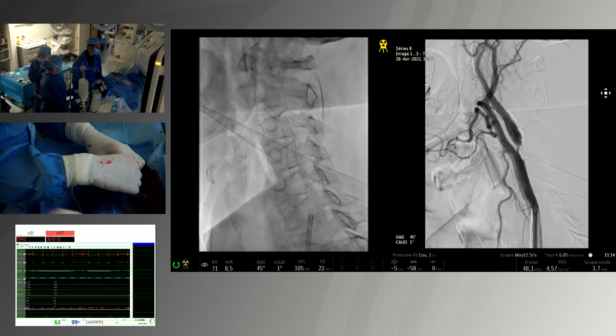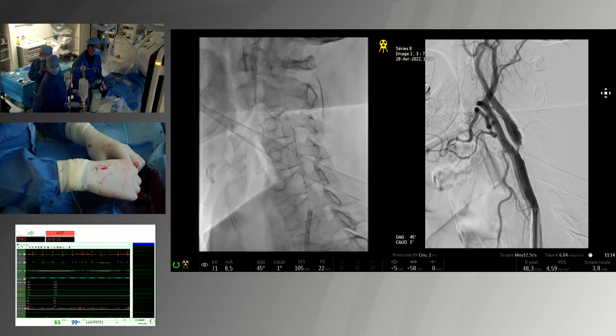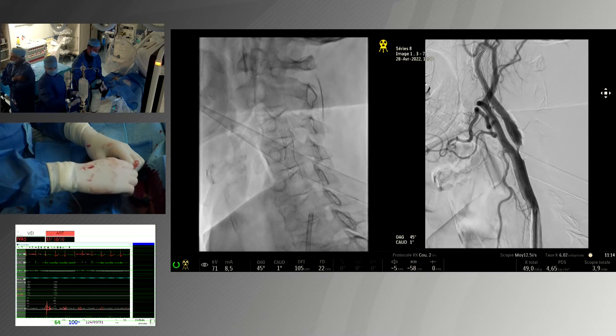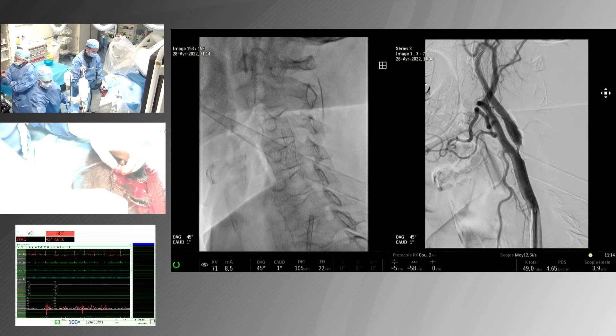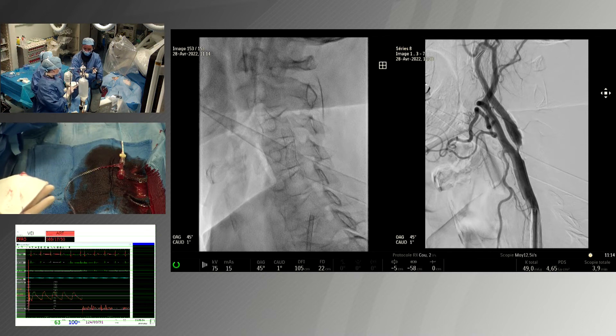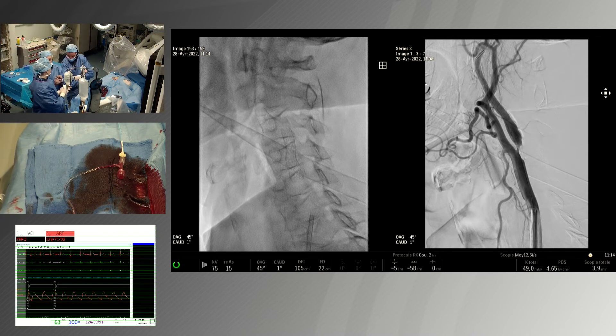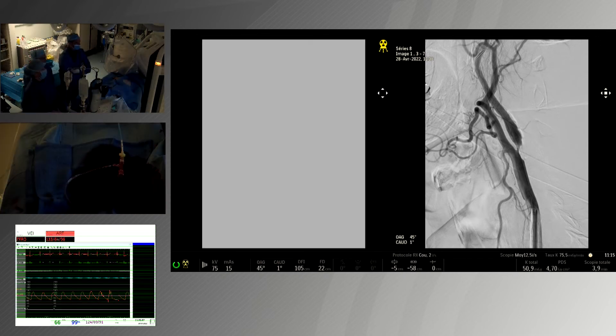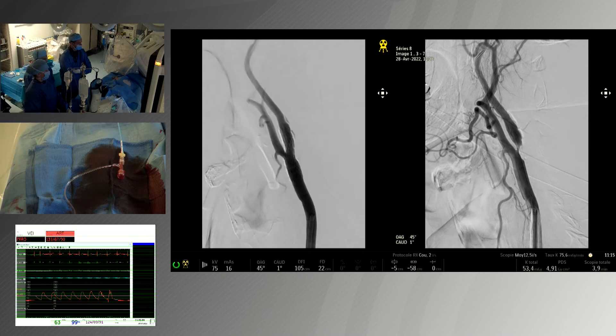This kind of lesion — this patient is asymptomatic. You could say to the patient: take some statin and antiplatelet therapy. You can see the stenosis was ready to close. We can see the filter, and there is some debris in it.